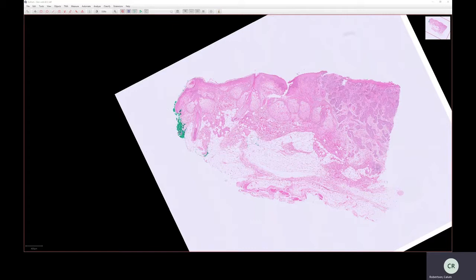And so it is probably quite helpful to have a quick run through of the basics, the basic principles of histology, looking at H&E slides. Some of which will be revision and some of which will be new, to give a foundation before you start reviewing live slides and teaching cases with consultants.